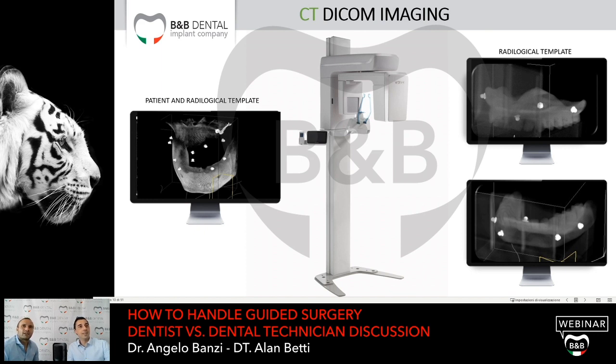For the second exam, it's required just the radiological template. Why? Because the second exam normally is taken with a low irradiation. If you have to set the CT machine or ask for a setting, this setting is going to be the same that we use for children.